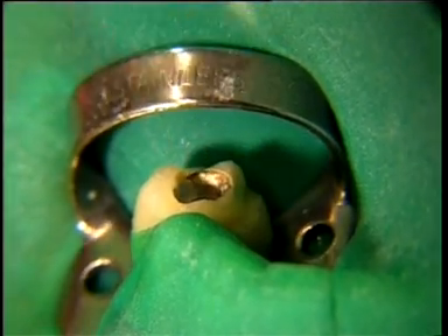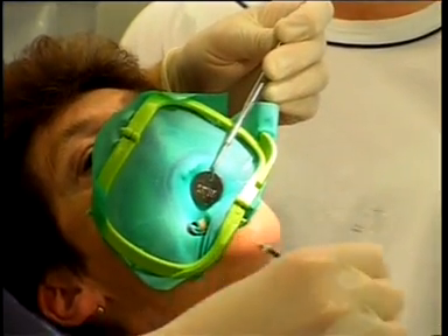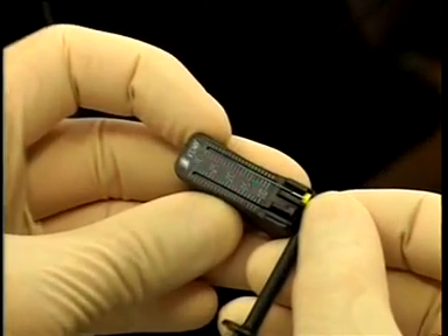Once the measurement is completed, we remove the file from the root canal and the lip clip from the mouth of the patient. We have determined a working length of 20mm.